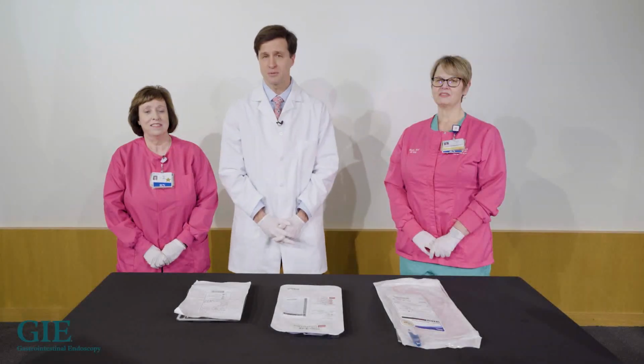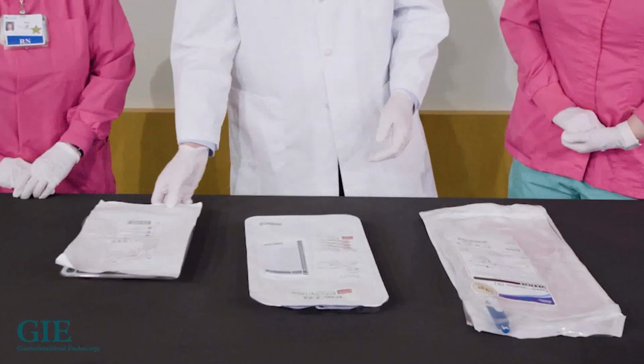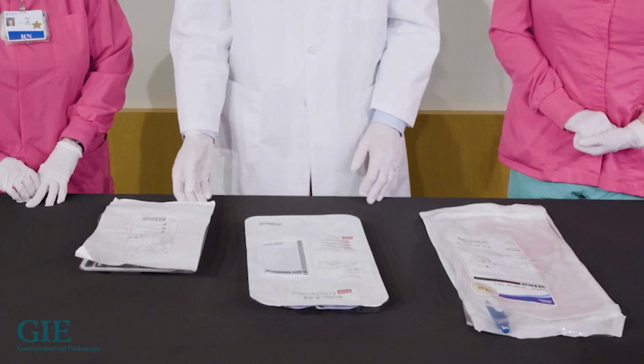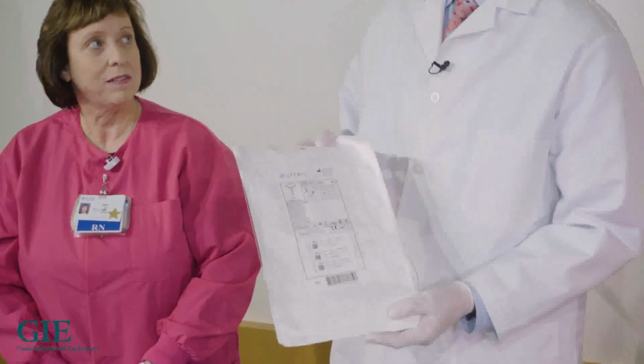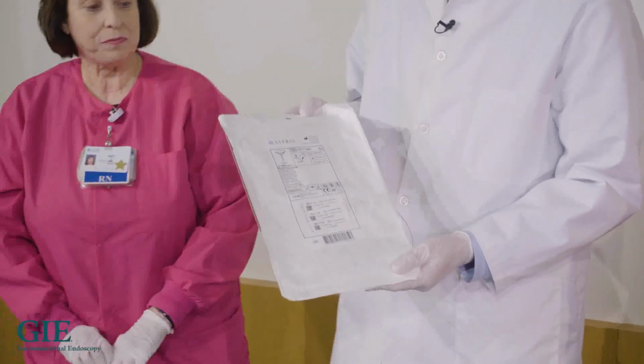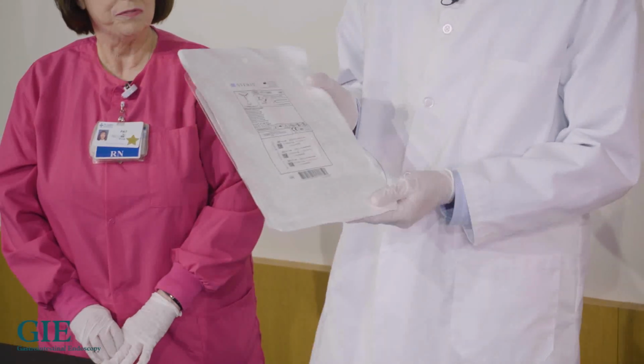Welcome to the hands-on portion of our video today. We're going to talk about some of the equipment we use in our advanced endoscopy suite here at St. Luke's. We have some equipment here to show you guys today. For those that have used it before, thank you for joining us, and those that haven't, then welcome to the new equipment. So this is the through-the-needle forceps, Steris micro forceps. They go by many names, Moray micro forceps, and they're forceps that go through our EUS needle.